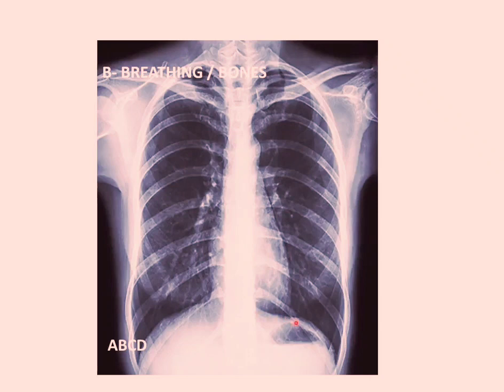Okay, now you can see below the left dome of the diaphragm, or shadow of the left hemidiaphragm, the dark shadow which is normal. Again, the dark shadow is due to air, and this air is present in the fundus of the stomach, which is present below the left dome of the diaphragm, right?